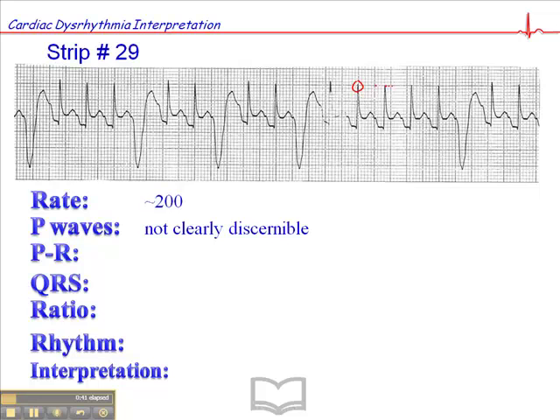We don't see P-waves anywhere — they're not clearly discernible. Although you might argue that this is a P-wave coming off the T-wave, because we see it consistently here, and we see it sort of there, and we see it here, we see it here. It would be fair enough to call this a P-wave.